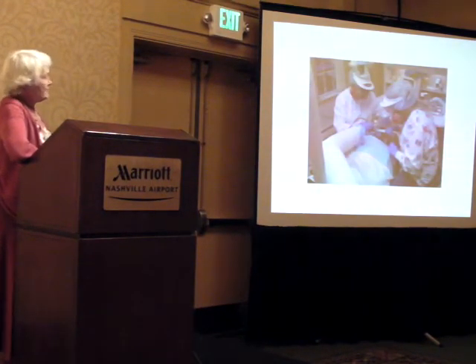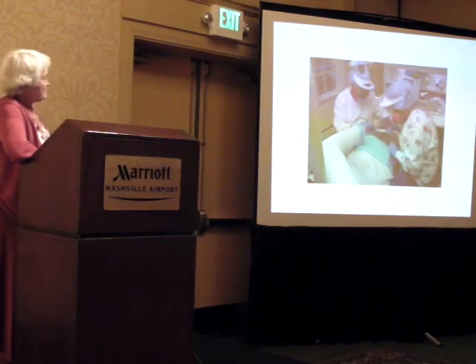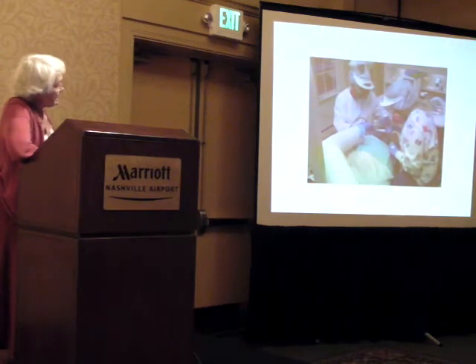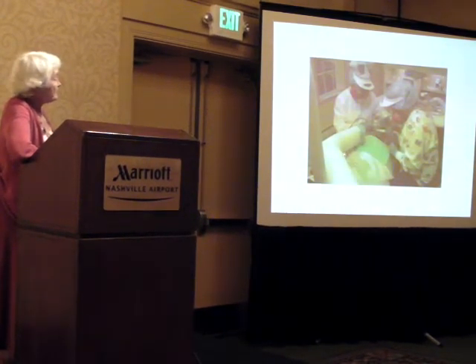And we do wear a visor to protect our faces over and above the separate air supply. Here you're seeing me and my assistant with respirators. These are like the IABDM respirators. That is the patient under there. There's not much exposed, as you can see.